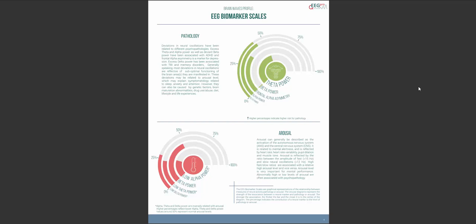Bars below 50% correspond with low arousal, while bars above 50% correspond with high arousal. Here there are clear indications of low arousal, since there is a high amount of alpha power, a high amount of theta power and high amount of delta power. So you can see that alpha power, theta power and delta power are inversely related with arousal. So the higher the alpha, the lower the arousal and the higher the theta, the lower the arousal. And again, the higher the delta power, the lower the arousal. So in this case, it's a clear example of the low arousal.